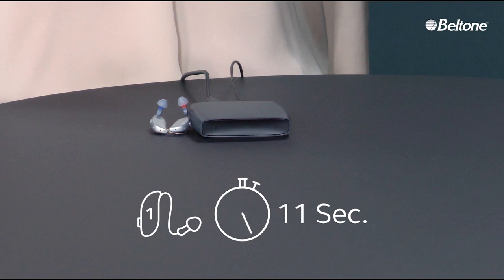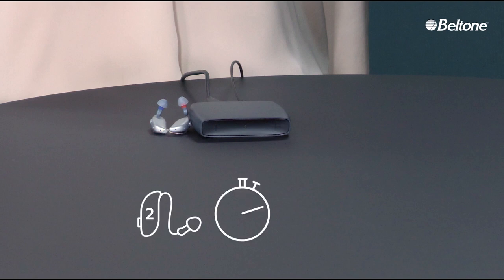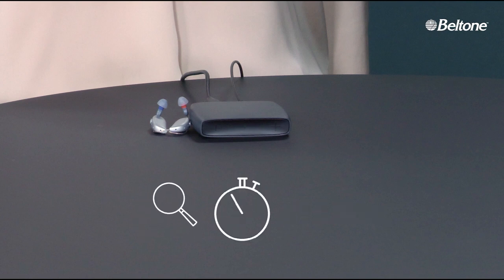Graphics appear showing the first hearing aid and a stopwatch counting to 12 seconds. The light stops blinking and a checkmark icon appears. The next set of graphics shows the second hearing aid and the stopwatch, with the light blinking again. As soon as the count reaches 12 seconds, the light stops blinking and a checkmark icon appears.